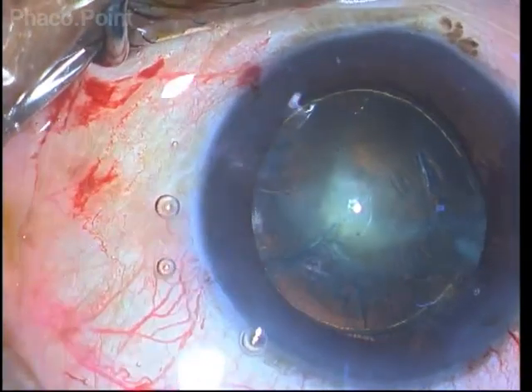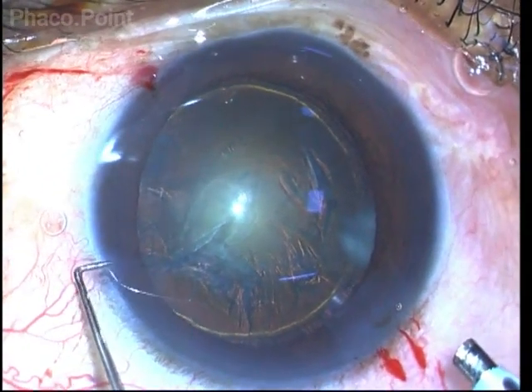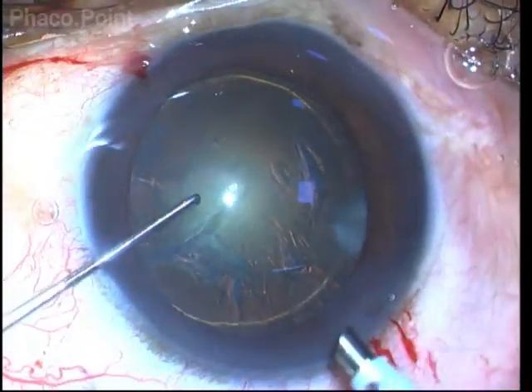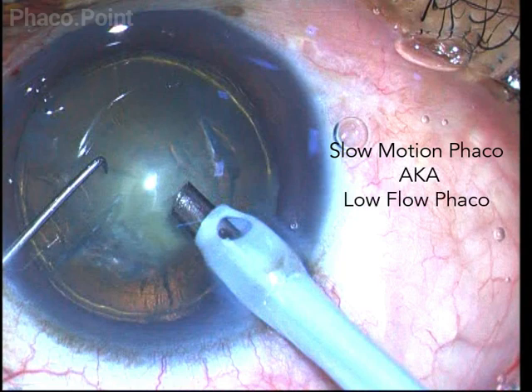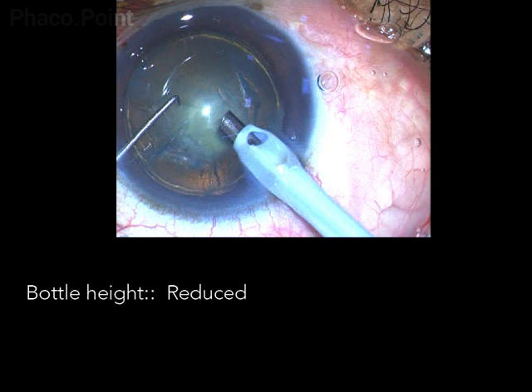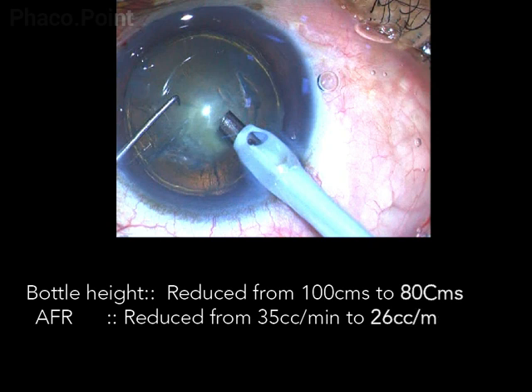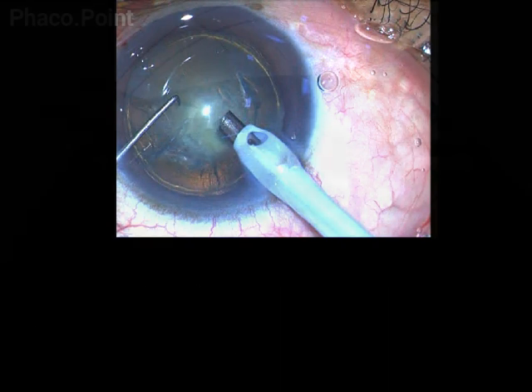For nucleus management we need to employ what is known as low flow parameters, or slow motion phaco. The bottle height, instead of the normal 90 to 100 centimeters, is kept at around 80 centimeters. The aspiration flow rate, instead of the normal 32 to 35, is now kept around 26 to 28 cc per minute, and the vacuum, instead of the usual 350 mmHg, is now kept at around 260 to 280 mmHg.